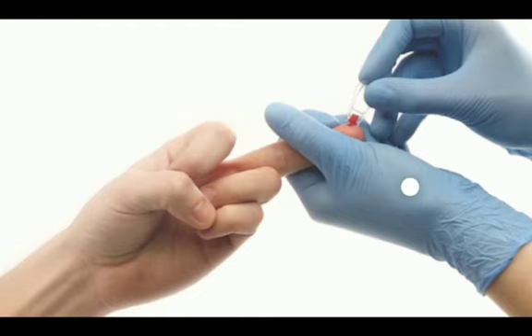Do not leave a tourniquet on the patient's arm longer than 1 minute, because prolonged tourniquet application may produce erroneous test results. We have another note: when the blood is collected for blood alcohol estimation, do not use alcohol to cleanse the puncture site, and do not use iodine tincture because it contains alcohol. If you want to determine the alcohol in the blood, you can disinfect the area of puncture with povidone iodine instead of alcohol or iodine tincture.